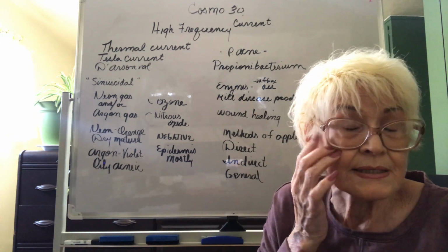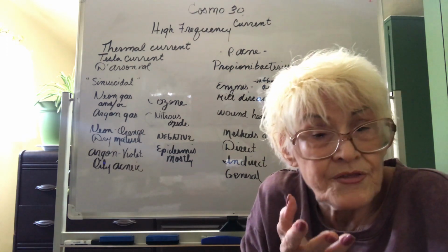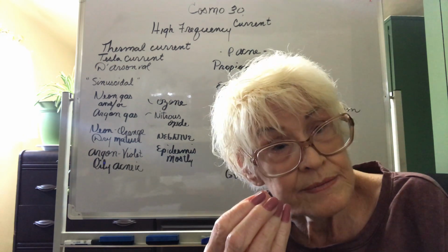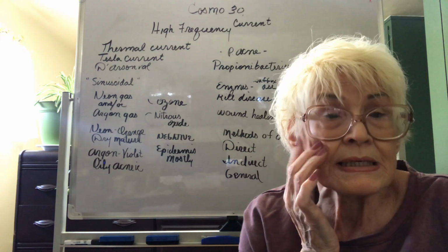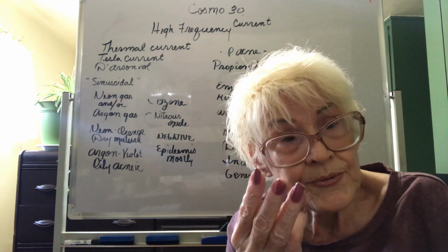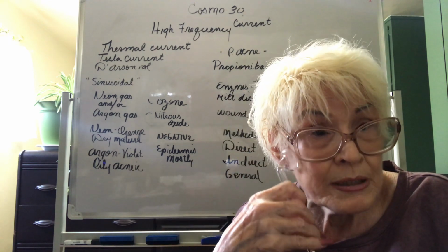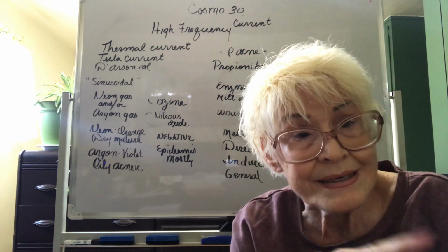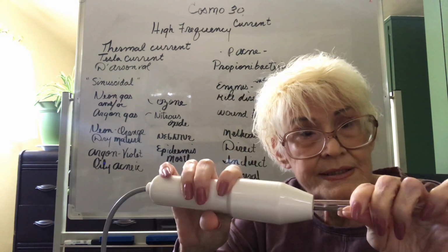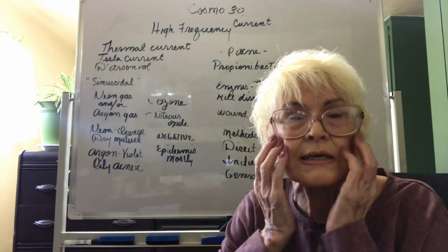Now what's happening is the electricity is coming up through her body, up through the subdermis, up through the dermis to the epidermis. So as you're applying tapotement, I'm bringing electricity up into all 3 layers of the skin. Remember the direct method, only epidermal. But when I'm using the indirect method, when the client is holding the electrode like this, and you, the technician, are doing tapotement.